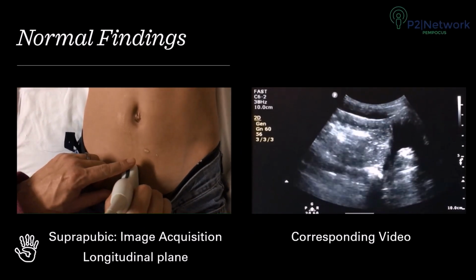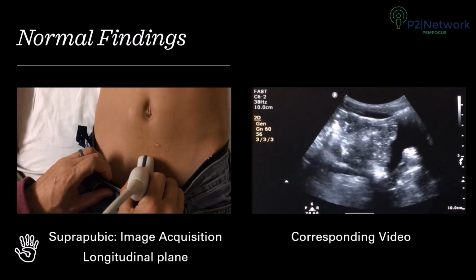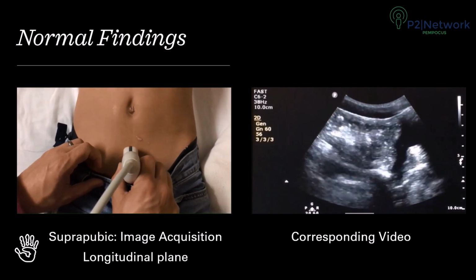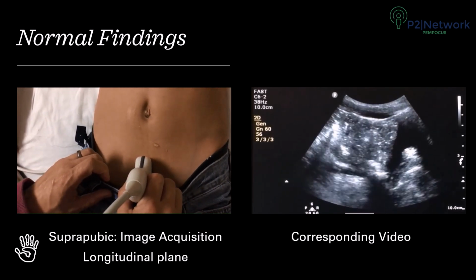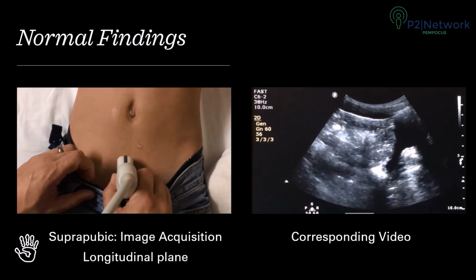In the sagittal view, the bladder has a more triangular shape. The probe marker is pointed towards the head in this view, and so the left side of the screen in the image represents where the patient's head would be. As you fan side to side, you are able to see the entire area behind the bladder to look for fluid.